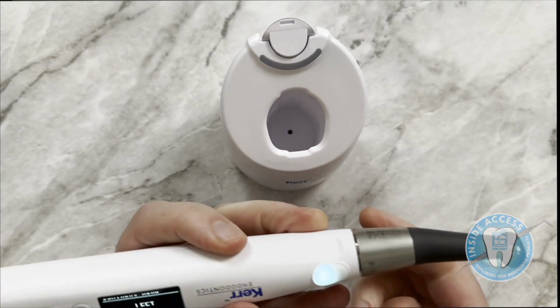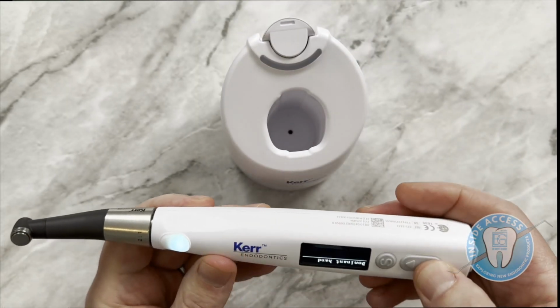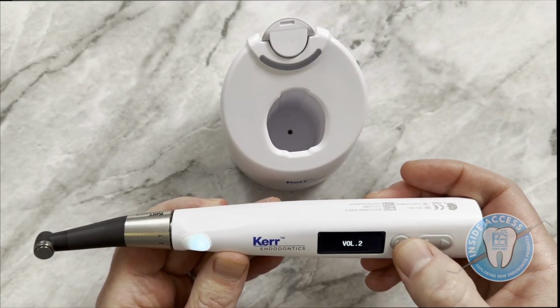So I think this is a really cool feature. You can also adjust the volume, obviously. You can adjust it up or down. You can leave it at 0.